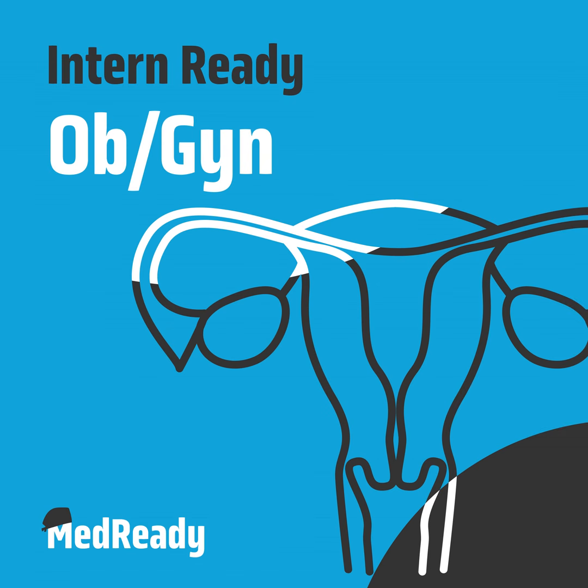And it's hard to know that as an intern because you're always going to give less force. Yeah. And honestly, we probably perf more than we even know, even with our non-hysteroscopy dilation procedures. And ultimately, everybody will do it. And it most often feels like a loss of resistance. Like you go in and then you're just in air. And that often means you're in the belly. Yeah.